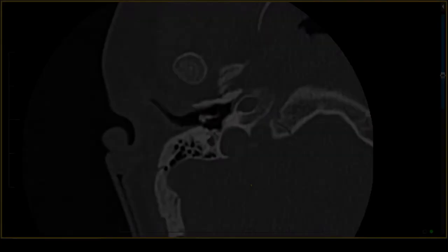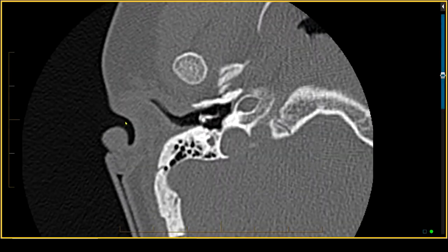This is a really great example of all the potential things that can go wrong unfortunately with hearing in a child with Down syndrome. This patient had both conductive as well as sensorineural hearing loss.